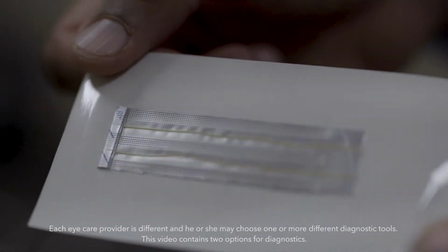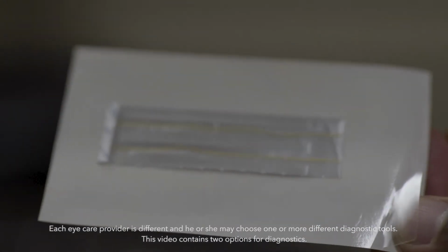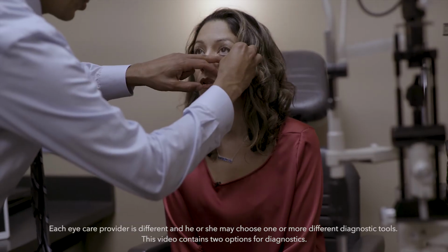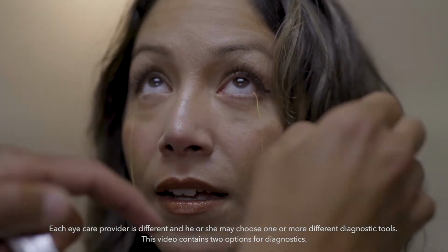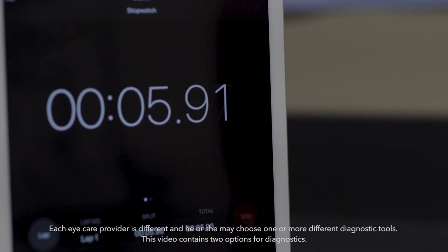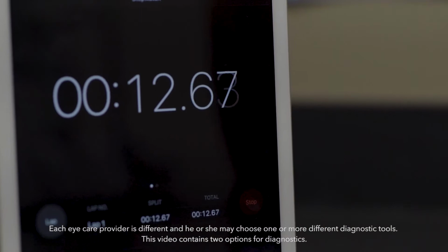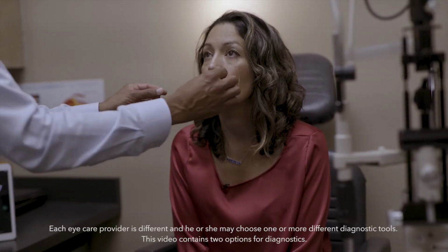This is the Zone Quick Phenol Red Thread Test, PRT. Take it out. Look straight ahead. It just hooks right into that little lateral canthal. Beautiful, that's perfect. And then 15 seconds. You just look straight ahead. You can blink, no problem. It's okay if you do that. We're just measuring how much tear film you're making. When the tear hits that thread, the yellow turns red. And that's how we measure.